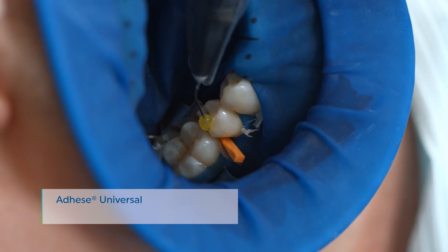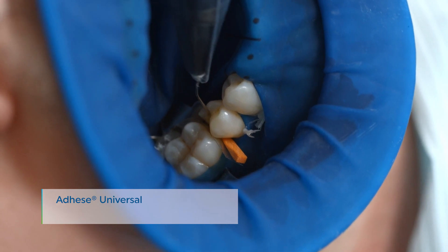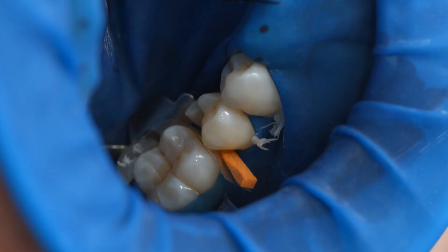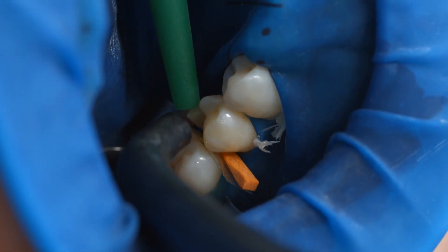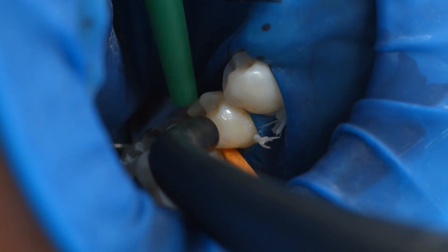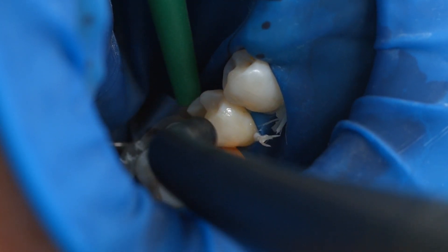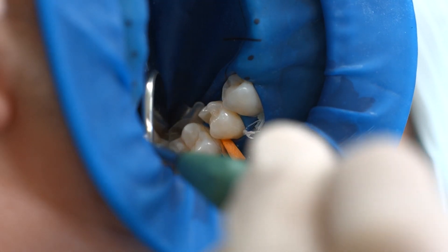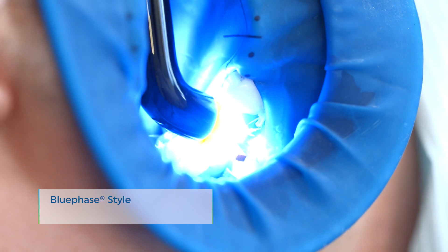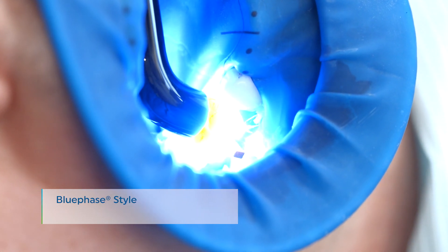Coat the entire bonding surface with Adhese Universal and scrub the adhesive in for 20 seconds. Start the procedure with the enamel surfaces. Disperse excess amounts of Adhese Universal with a stream of air until the mobile liquid film has disappeared. Make sure to avoid pooling. Light cure Adhese Universal for 10 seconds using a curing light with a light intensity of at least 500 mW per square centimeter, for example blue phase style.